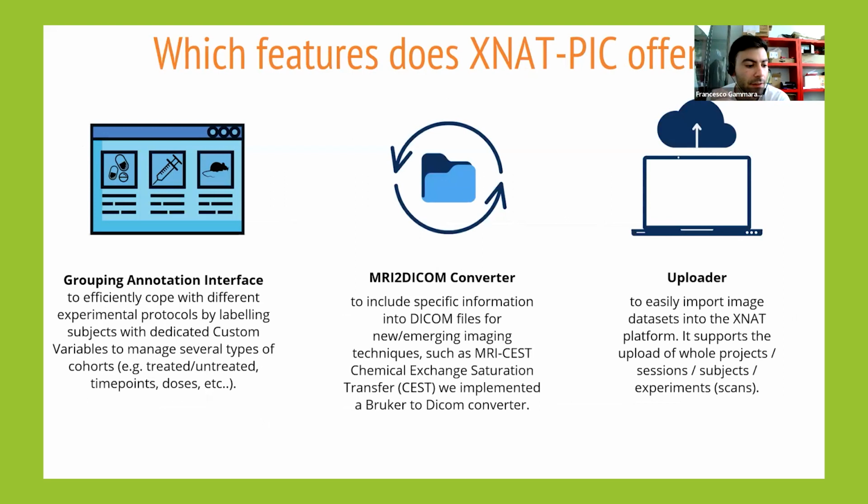So this interface allows you to select your project, and you can edit the custom variables that you want to add, such as groups, time point, doses, and so on.